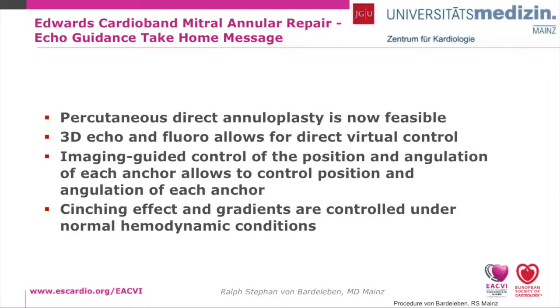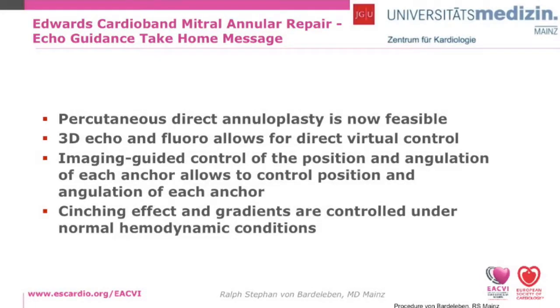This is especially true if the leaflets are very weak or very short, or if the examiner has bad images to control the grasping of the leaflets. So in modern times, this is a rare complication. You can treat this with a second clip, and you can also prevent this with a second clip, because the second clip takes the pulling force off the clip for the leaflets. So to readily employ 2 clips instead of 1, if you have enough space, is one very easy component to prevent partial leaflet detachment.